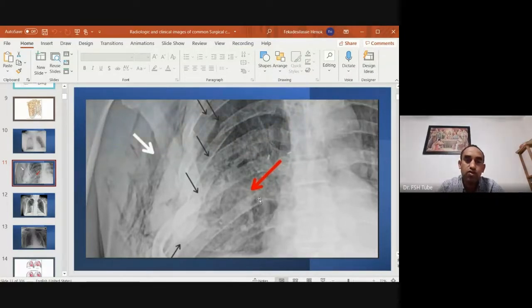Yeah, it could be. You cannot rule out contusion. You can see there is somehow right flail chest. Flail chest plus contusion plus subcutaneous emphysema. So this tells you how significant the trauma is, because to the extent the patient even has developed subcutaneous emphysema. Okay.